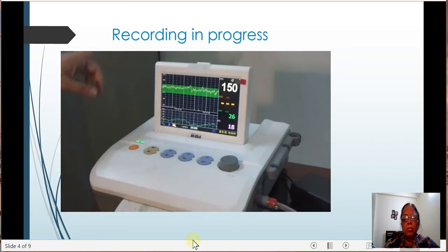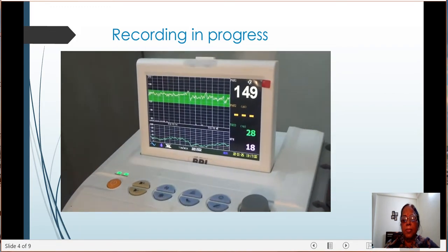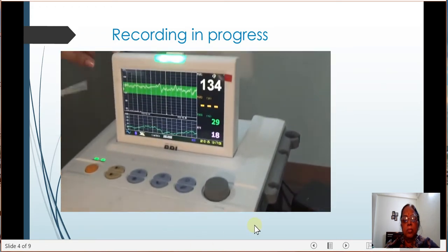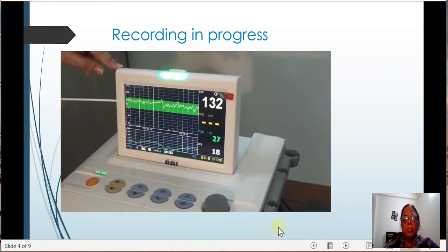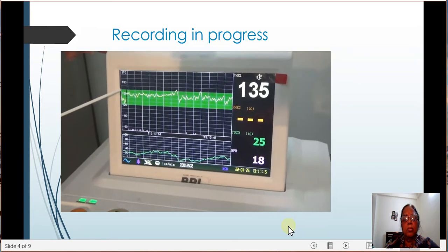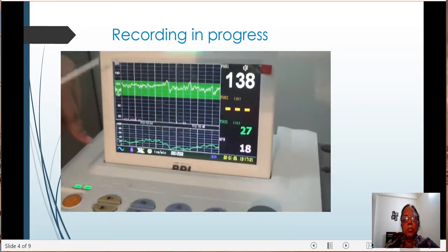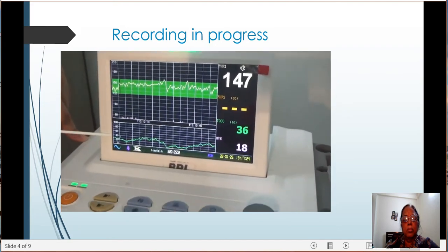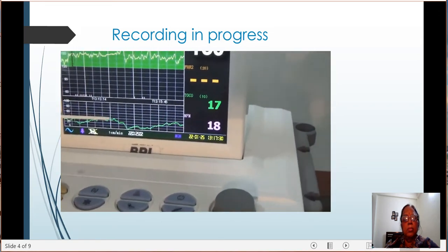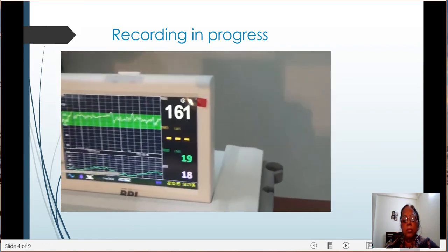Now we are seeing the machine over here. After placing both the probes in position, here in the machine we can see we have two parts. One is the screen part of the machine and the other is a print which is coming out from the machine. In the screen part, you can appreciate there are three important divisions. First division, this green line is showing us the heart rate of the baby or fetus. You can see this is the graph of the heart rate of the fetus coming over here. The second probe, the toco probe, was presenting the uterine contractions. This patient is not having a uterine contraction, so a baseline tocograph is coming over here.